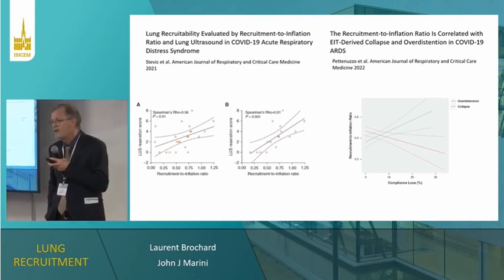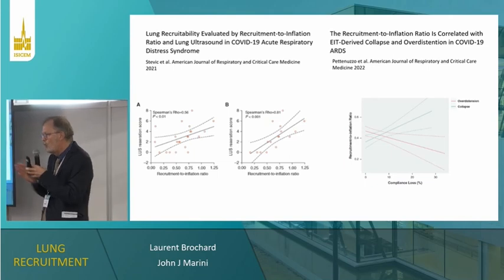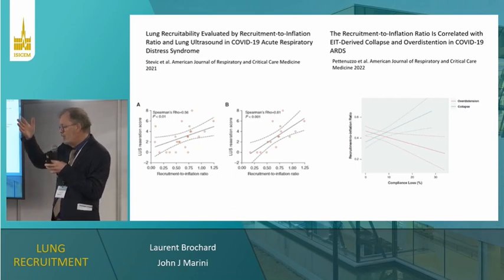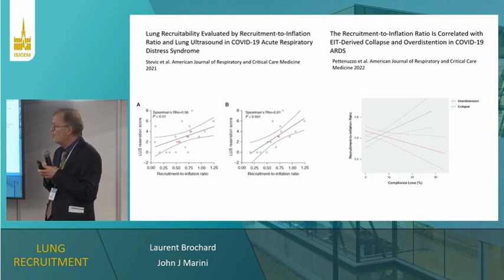influence that? Right, so that's a good point. And you will also see in the video explanation that you need to be sure there is no airway closure, which happens in some patients like tracheobronchomalacia, where in fact you decrease the PEEP, but the airway closes before you are at PEEP 5. And therefore, your calculation would be wrong because instead of going from 15 to 5, you may go only from 15 to 10. So in addition to that, you need to test whether the patient has airway closure.